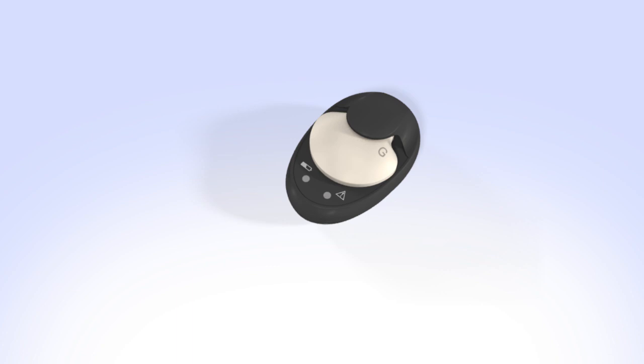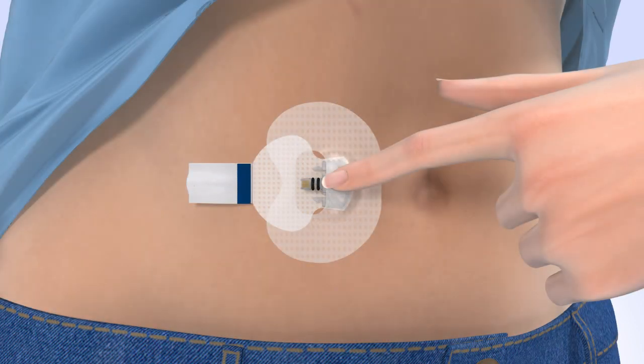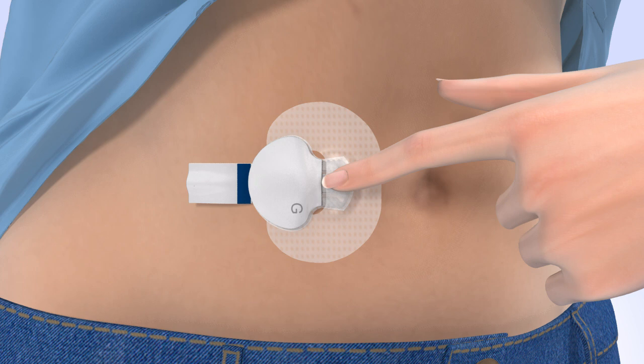To connect the transmitter to your sensor, remove your transmitter from the charger and watch for the green light to flash. With one hand, hold the sensor in place. Hold the transmitter with your other hand and push it onto the sensor — it will click when it is connected. The green light on the transmitter will start flashing within a few seconds, then turn off. If necessary, use a mirror to see the green light. If the light on the transmitter does not flash, disconnect the transmitter from the sensor and place it back on the charger until it is fully charged, then reconnect the transmitter to the sensor. Once the transmitter is connected, remove the adhesive liner from the adhesive tab. Fold the adhesive tab over and stick it on the transmitter. Be careful not to pull the adhesive tab too tightly.